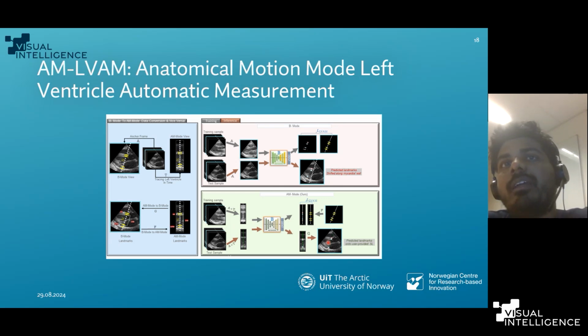But having a semi-automatic model is not bad, because I would say that this left ventricle measurement problem is kind of subjective, and different users have different ideas where the measurement should be performed. And generally for the same image, as I mentioned, there is inter-observer variability.